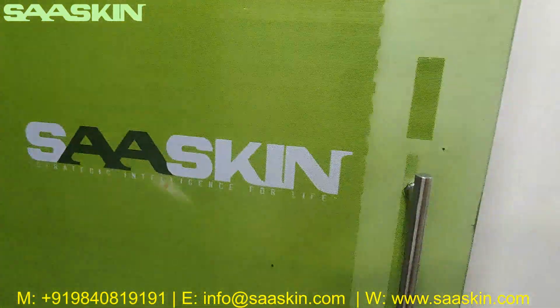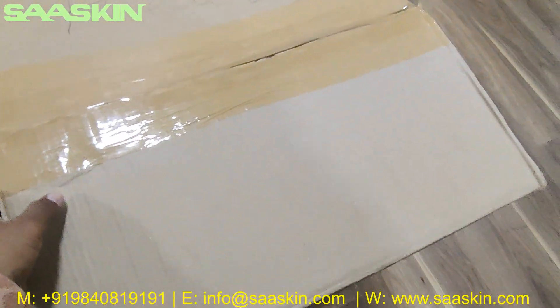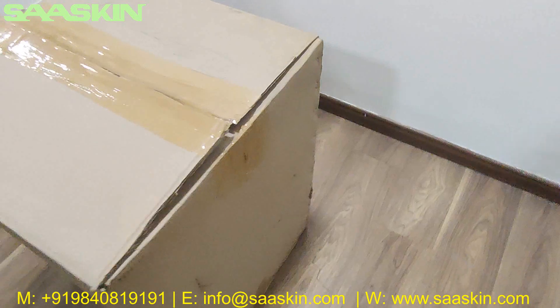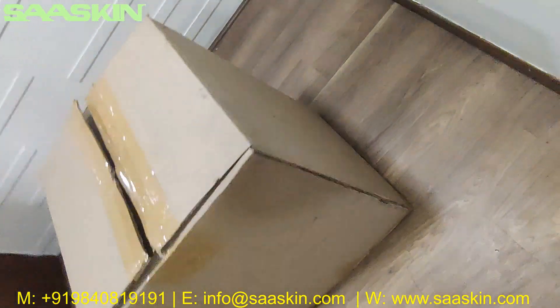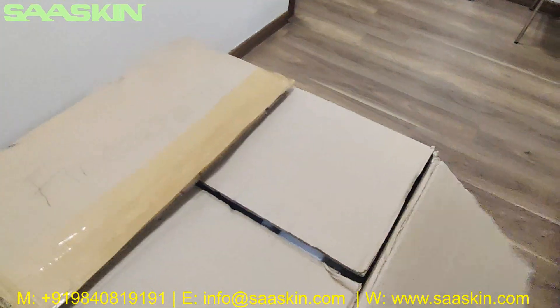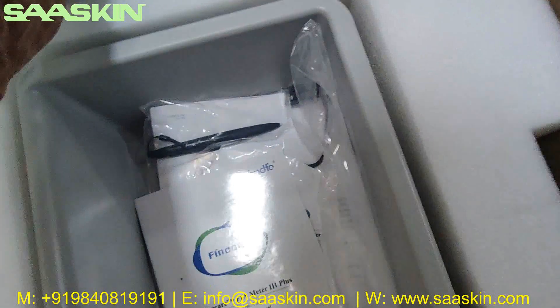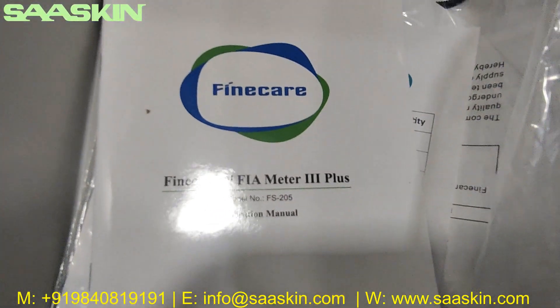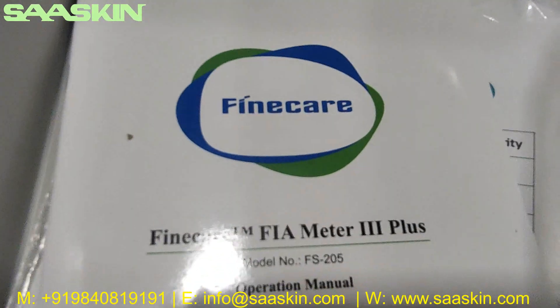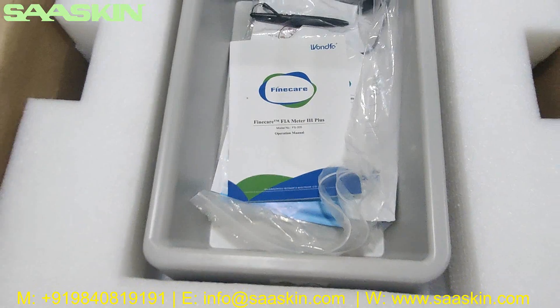Hello everybody, today we're going to see the unboxing of the Unfo Fine Care Meter 3. This is an Unfo Fine Care machine. You can see around the box there is no label on the outside. The model is the Unfo Fine Care FIA Meter 3 Plus, model number FS205.